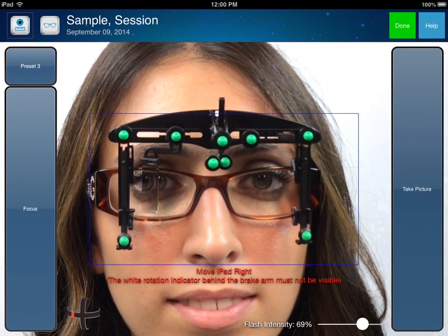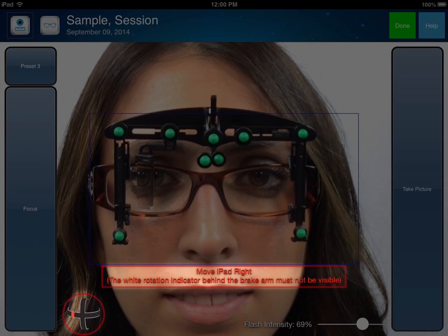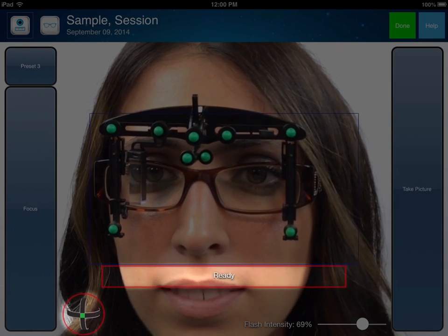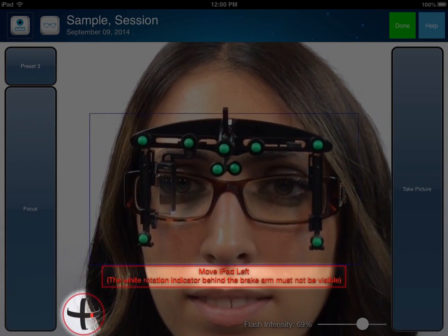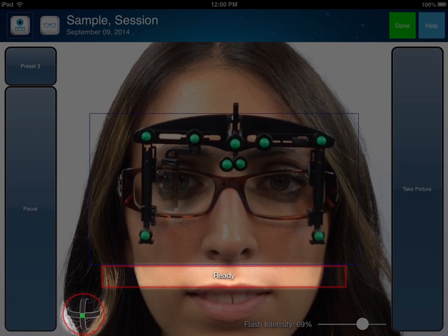While moving the iPad, the software will attempt to assist you in guiding your movement to eliminate head tilt and rotation. However, in certain lighting conditions, this assistance may not be available, and you may proceed to analyze the picture yourself and ensure correct sensor alignment.